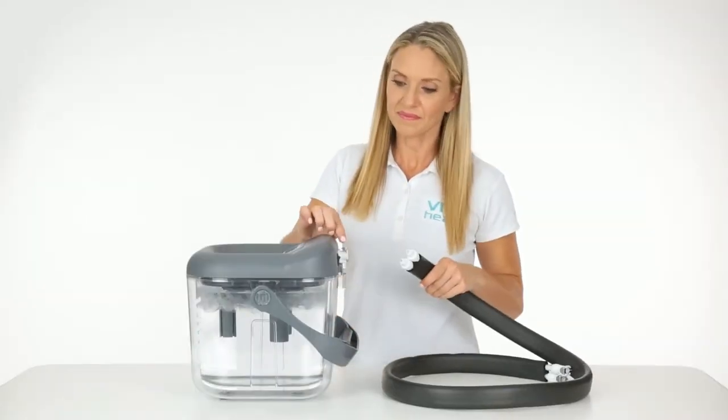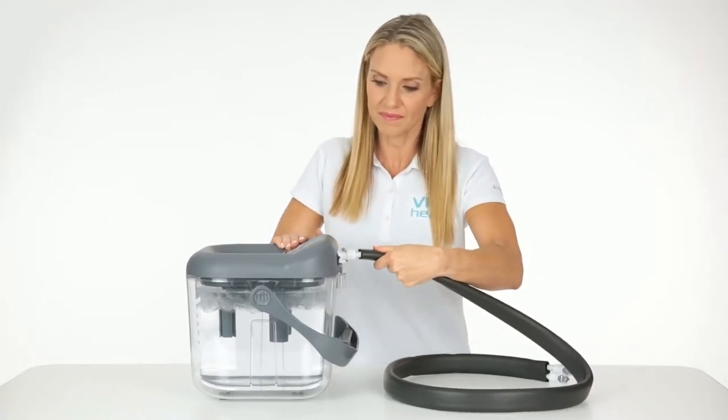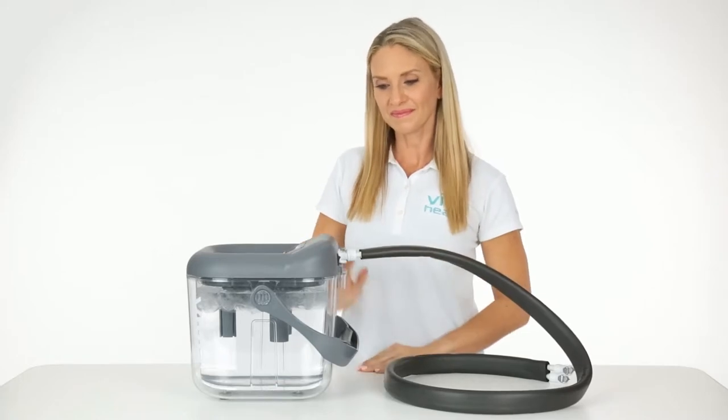To connect the hose, push down on the metal lock above each valve and push the hose nozzle in until you hear it click.